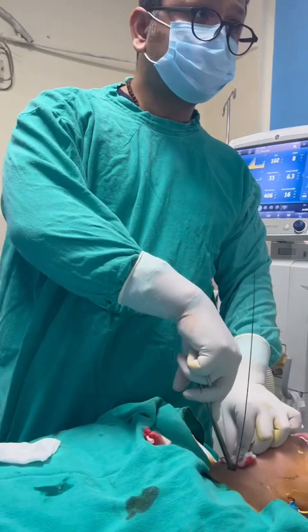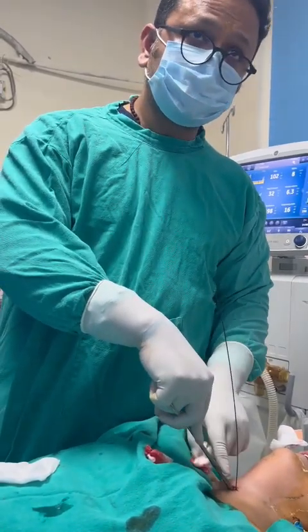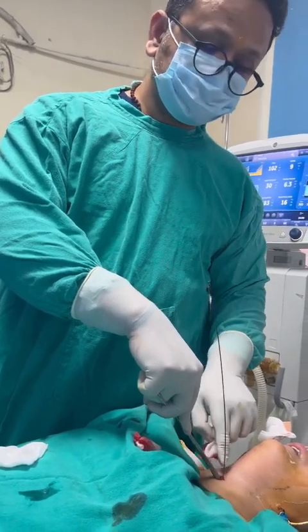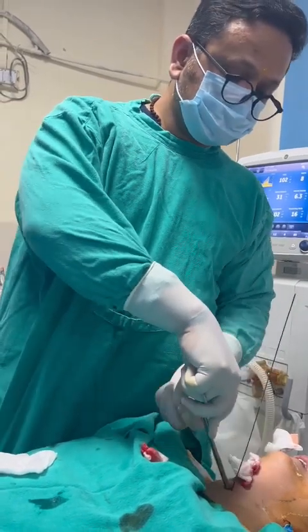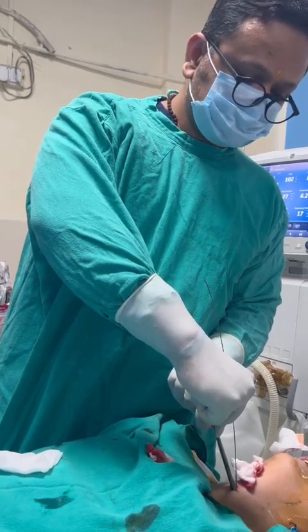Now it is engaged. Prashant, this is known as what? This is a single stage dilator, right? So this has to get engaged with the skin, the subcutaneous tissue as well as the tracheal stem. So now it is inside. Now I'm going to dilate it. Now you can see the gush up there as well.